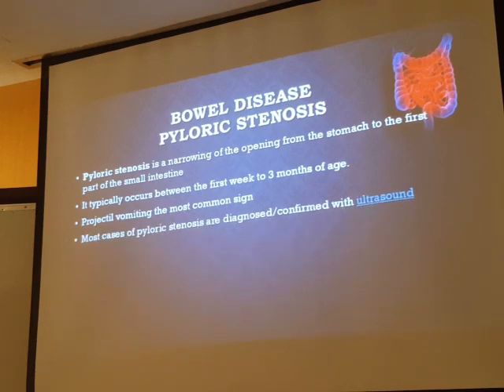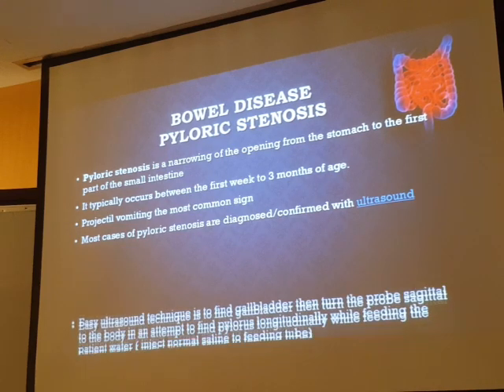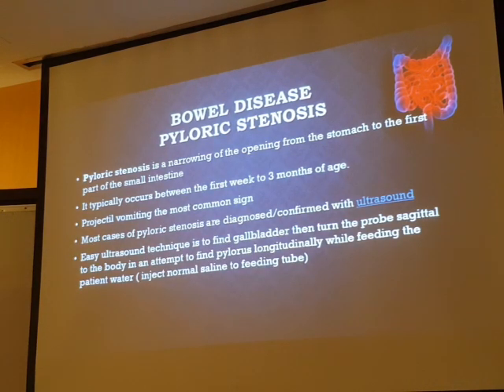In most cases of pyloric stenosis, the only diagnosis is by ultrasound. There is no alternative modality. Ultrasound is the modality, you cannot ignore that. Once the doctor suspects it, ultrasound is the modality to rule it out or rule it in. So it's an easy ultrasound technique.